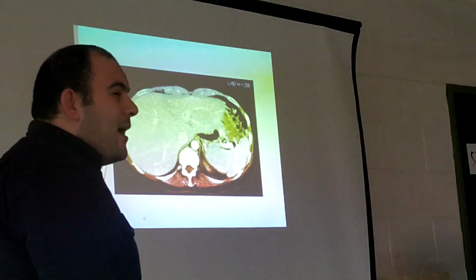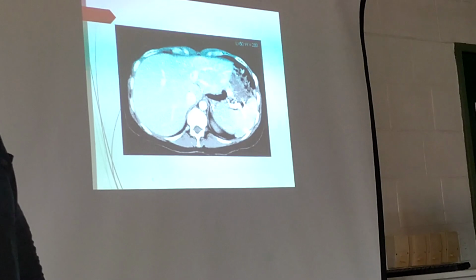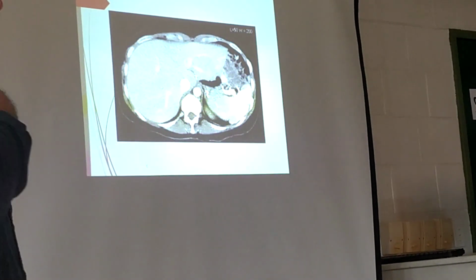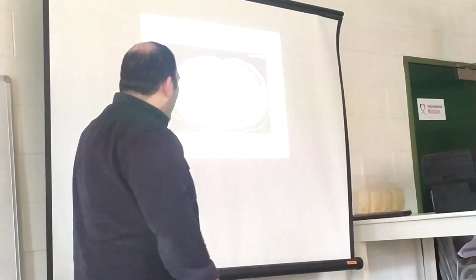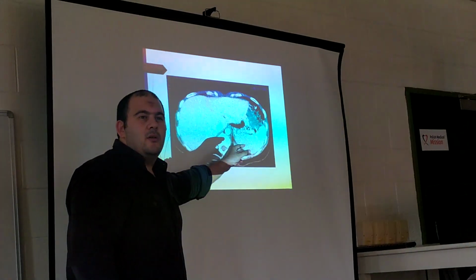Here, this is the image of CT. You will find different colors, not one color. Now, what's this? Is this bone or soft tissue? Bone. Why?